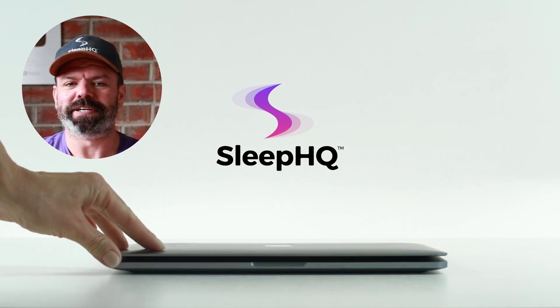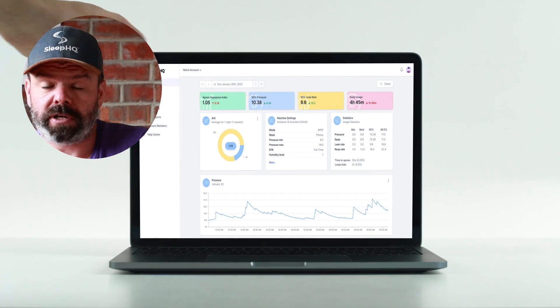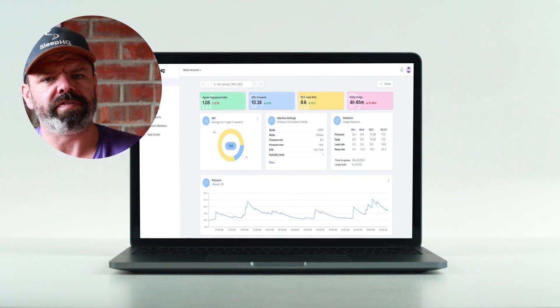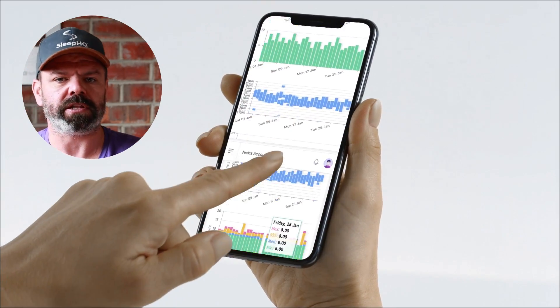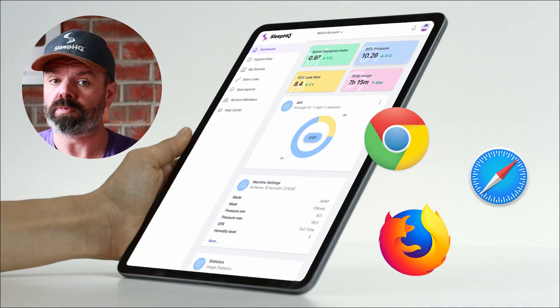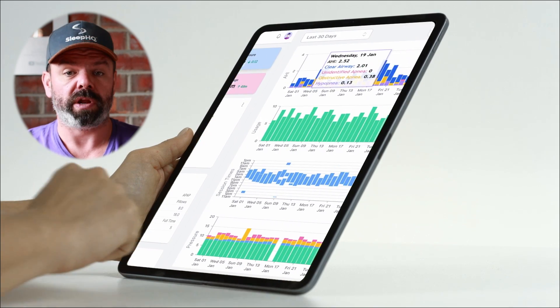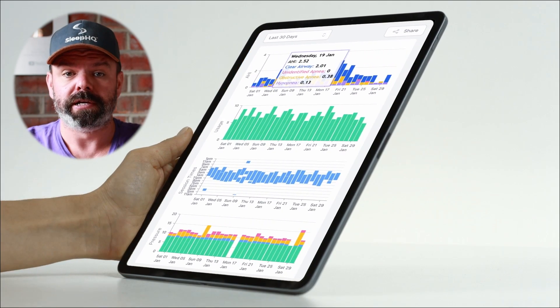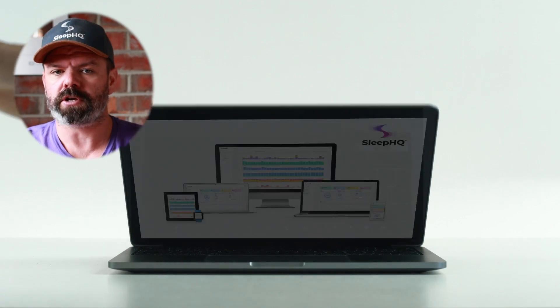SleepHQ is also a web application, so you can use it on any device with an internet browser like Google Chrome, Safari, Firefox — whatever you use. Just visit SleepHQ.com, sign in, and you're good to go.